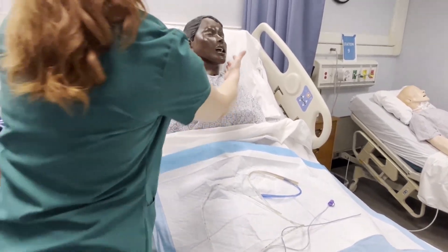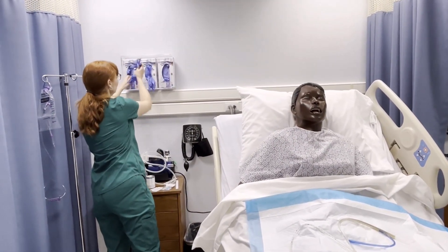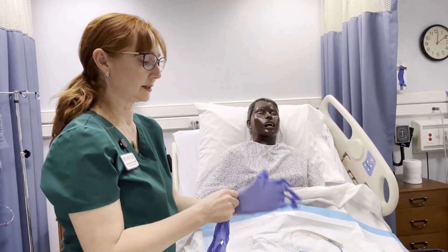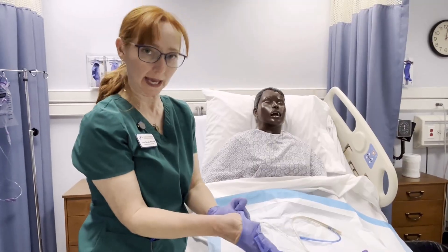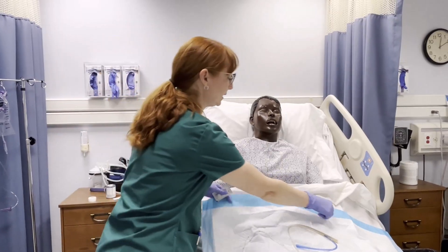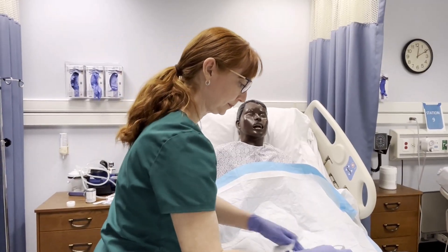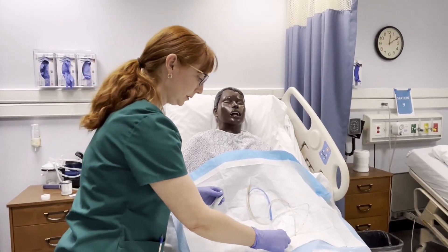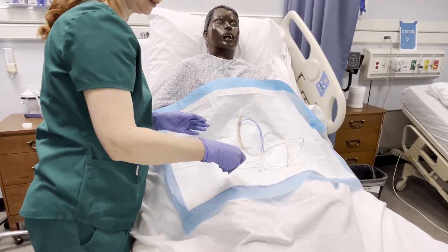You want your patient to sit upright. For this procedure you'd probably want to wear a mask and a gown. The patient has a high probability of gagging during this process, so having a Chux pad is a good idea. Maybe having an emesis basin or a blue bag would also be helpful. You want this tube to be well lubricated so that it can go easily into your patient.